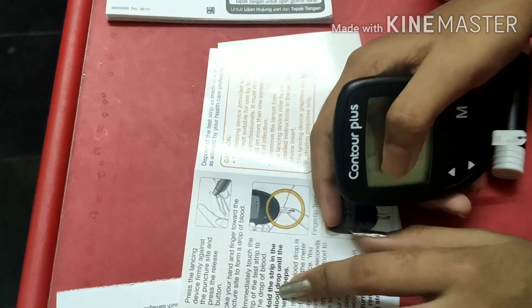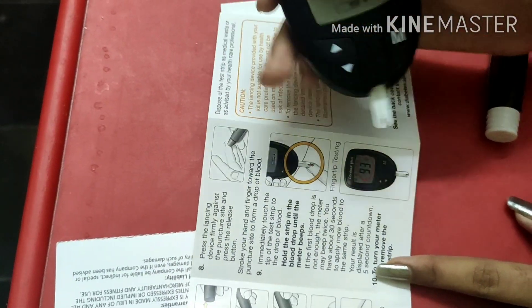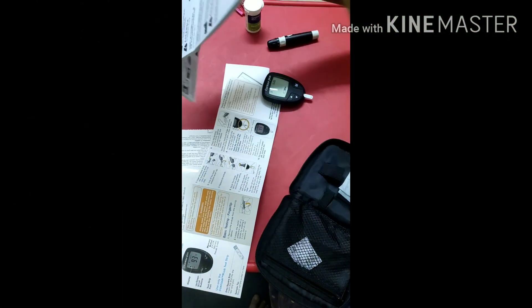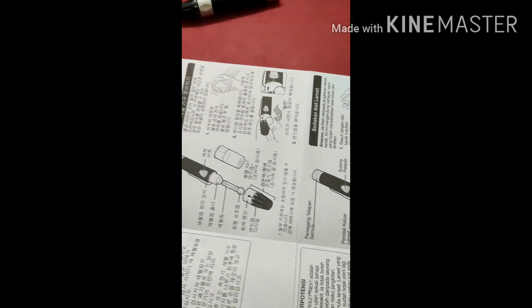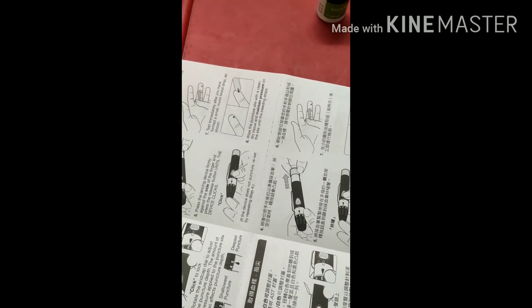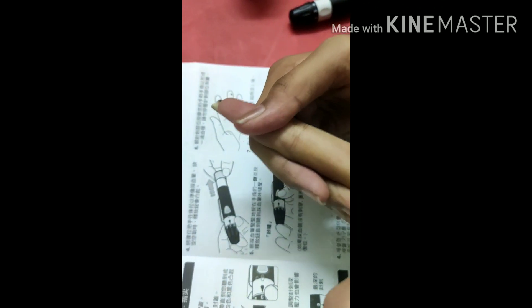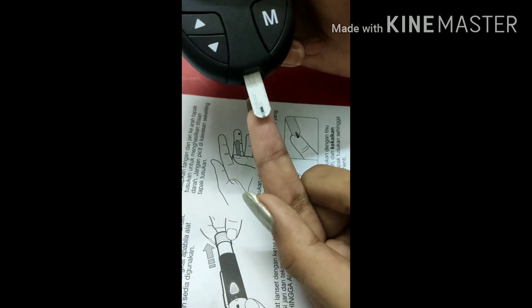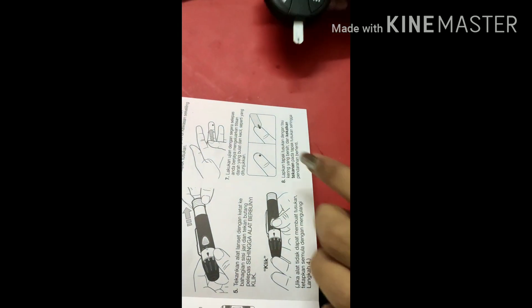Immediately, just touch the tip of the strip with the blood drop. After getting blood on the strip, you should do this — hold it upward and just touch the corner of the strip lightly like this. Don't press directly — just touch at the corner.